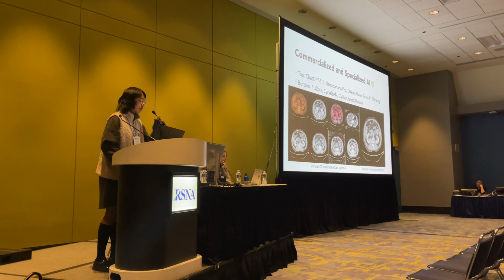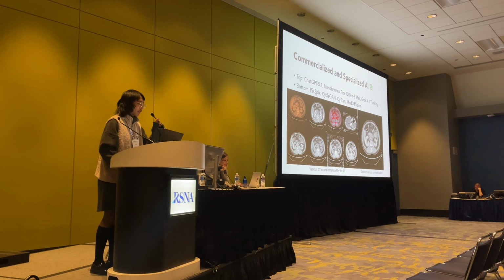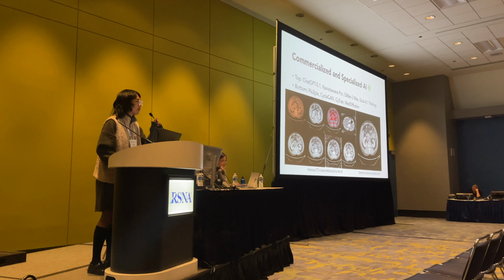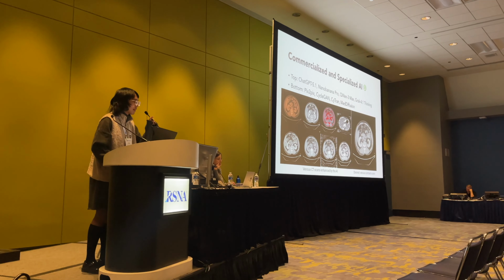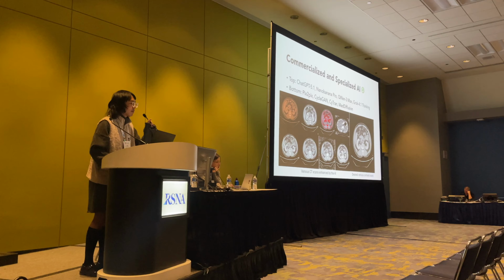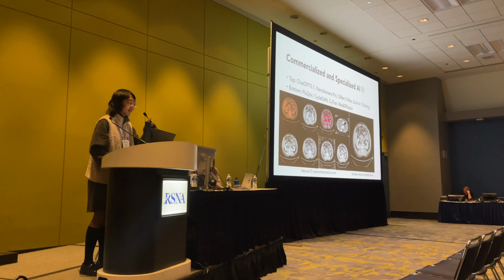Here, we found that commercialized and specialized AI fails to do so. Commercialized AI is very popular in our lives. You may use it to create memes, but for precision, it is under concern. At the top, we show the enhancement results to the desired venous phase via the most state-of-the-art AI models. At the bottom, we show some AI models specialized in medical imaging, just for fair comparison.